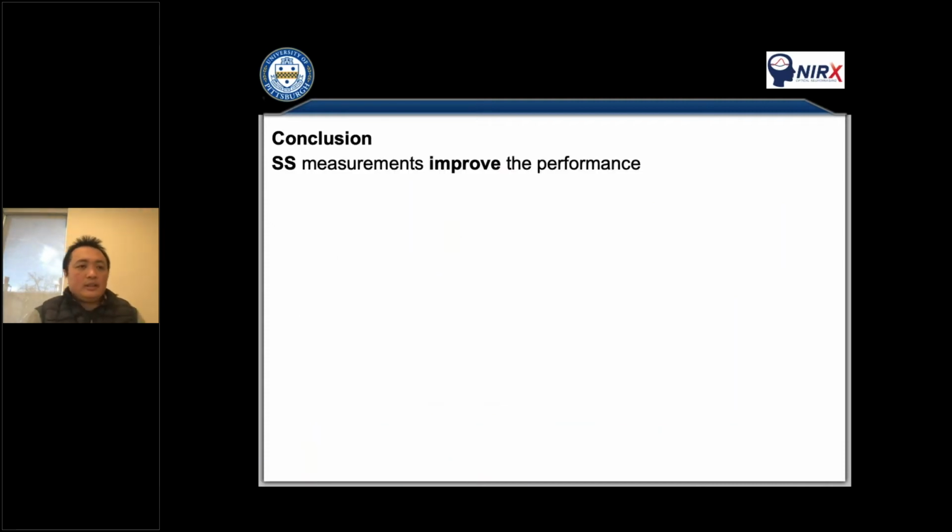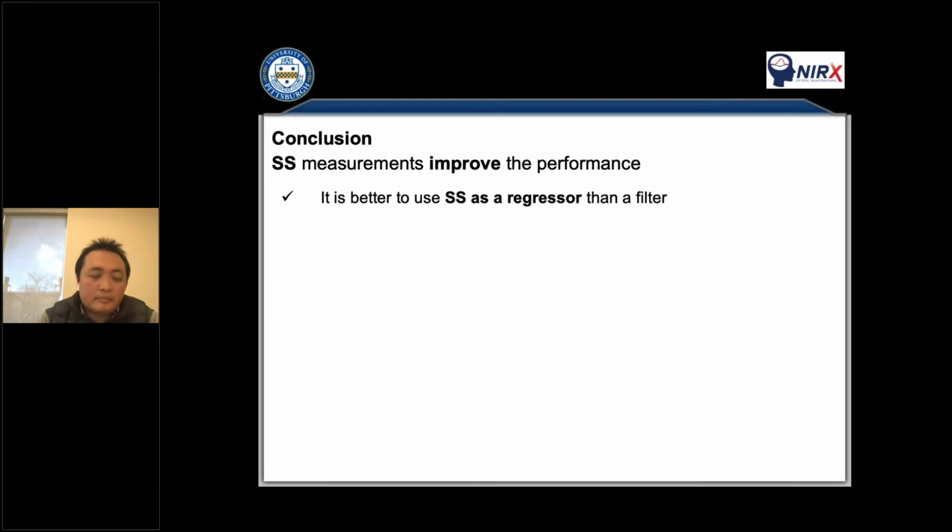So the conclusion is that short separation measurements improve the performance. It is better to use short separation as regression than as a filter. Mostly in the literature, when people first learned about short separation, they mostly used it as a pre-filter, but in this study we saw that it is better to use short separation as regression.